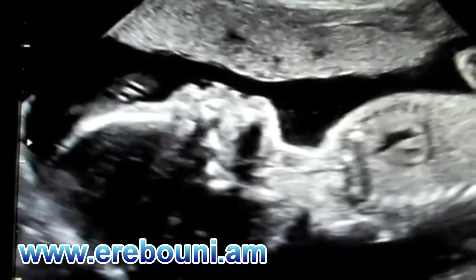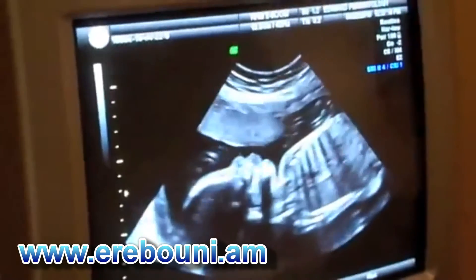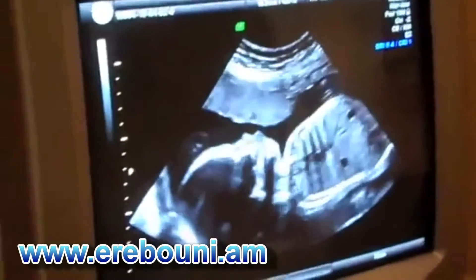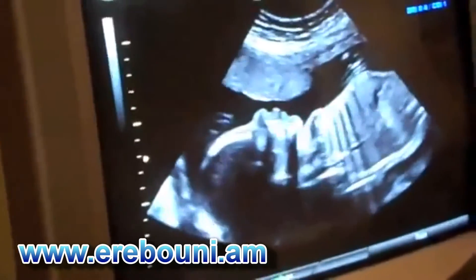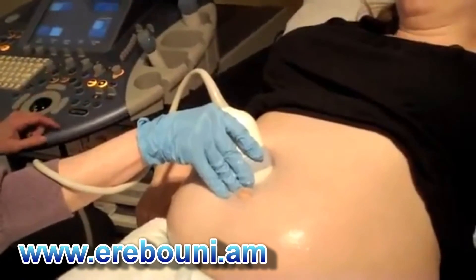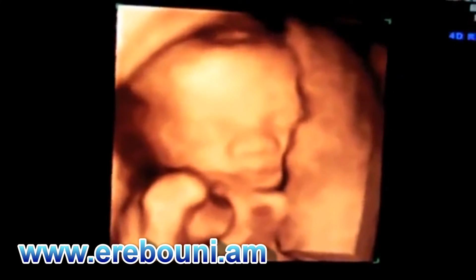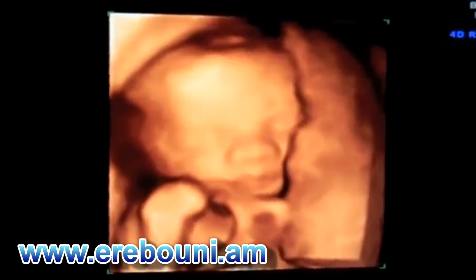In the third trimester, ultrasound is most commonly used to check for fetal growth, monitor the fluid and health of the fetus, as well as to confirm the location and the function of the placenta.